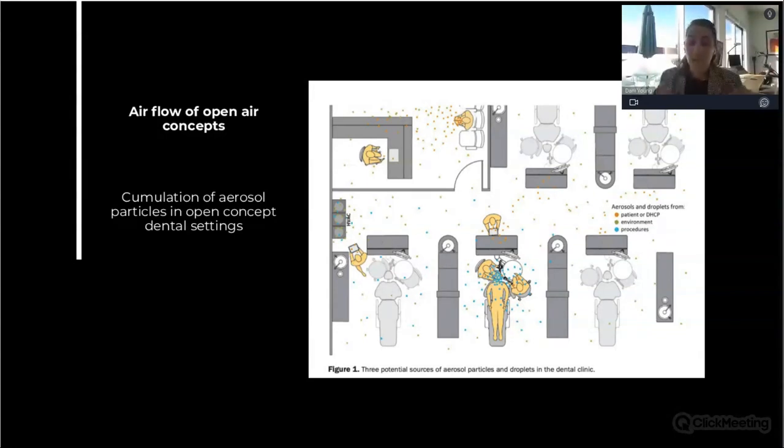So by using a tower or different types of modalities, even those air filters that just sit in the ceiling, we're able to constantly get the air particles and keep the environment as a variable out of the equation. That is really what we're trying to do: eliminate the environment as a variable.